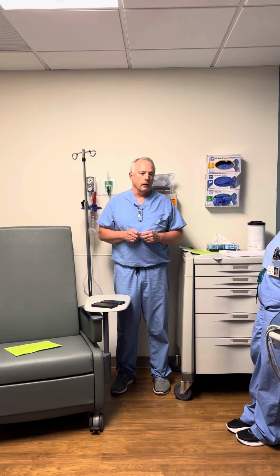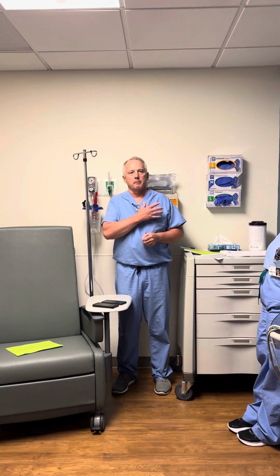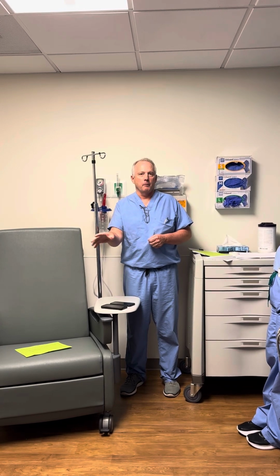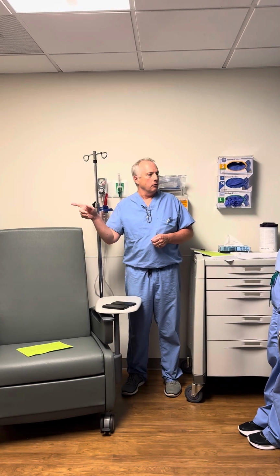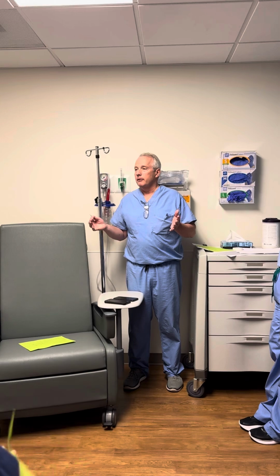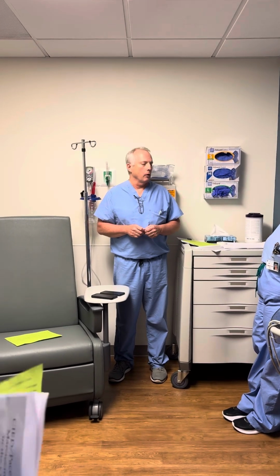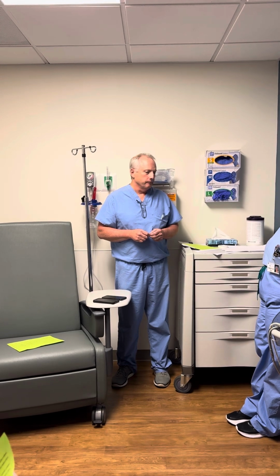We quickly found out it's better just to put a magnet on, because if the patient intraoperatively goes into a bad arrhythmia, it's much easier to pull the magnet off, allow the device to reactivate and provide therapy, than call the rep in, who may be 3 miles away doing something else, to come in and try to do something. Which is also why you have the crash cart or the monitor in there anyway, and the pads.